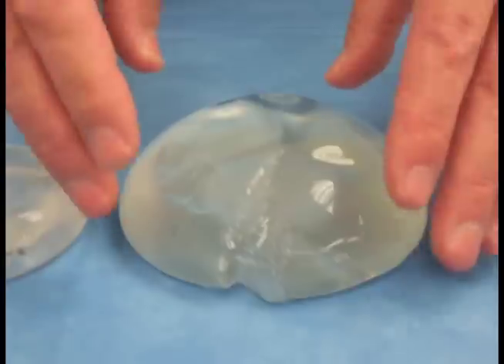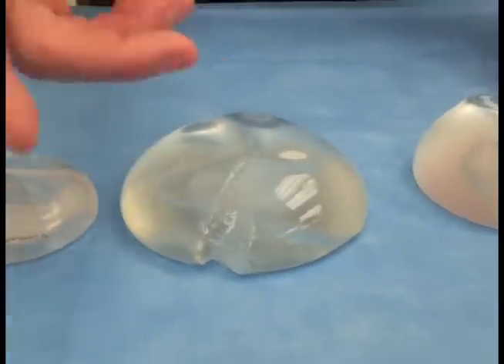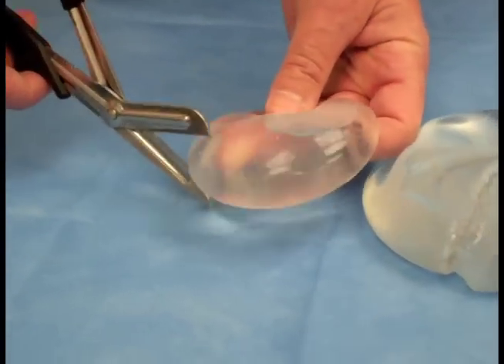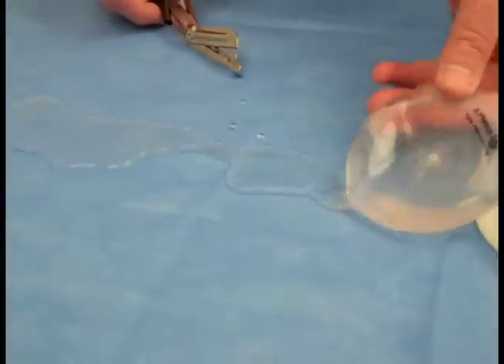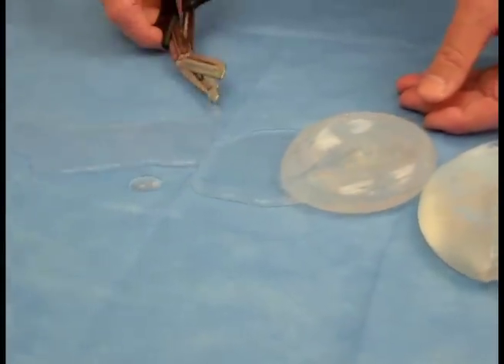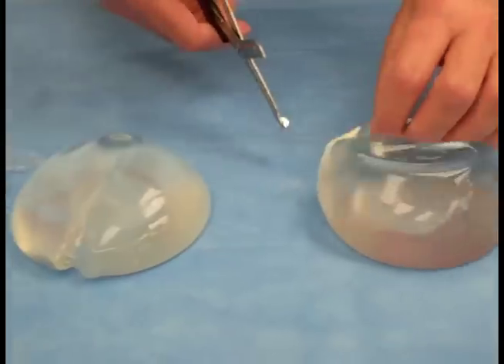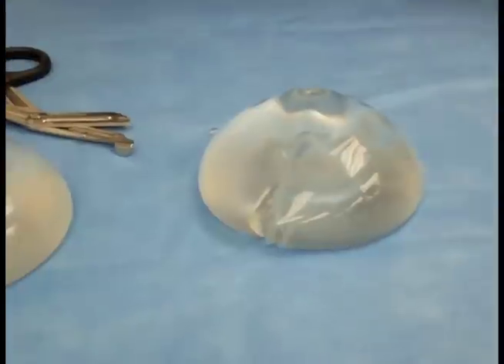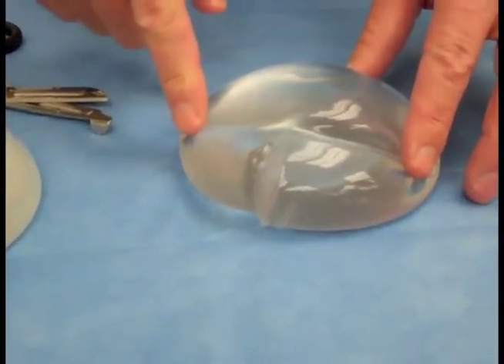As you can also see, it doesn't pour out. It actually cuts like a piece of pie, but it doesn't flow out. The difference would be, if you look at a saline implant, you cut it and it just leaks everywhere, which is fine because it's just salt water and that'll go into your system and get absorbed. This is what they call cohesive — it doesn't flow per se.